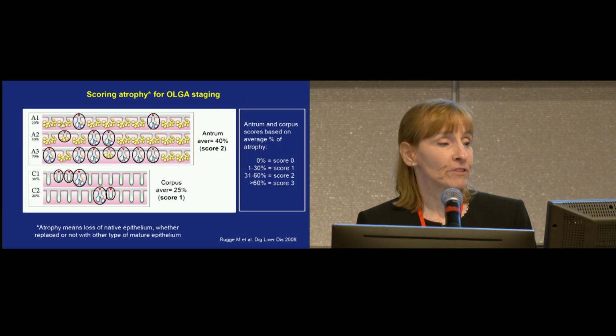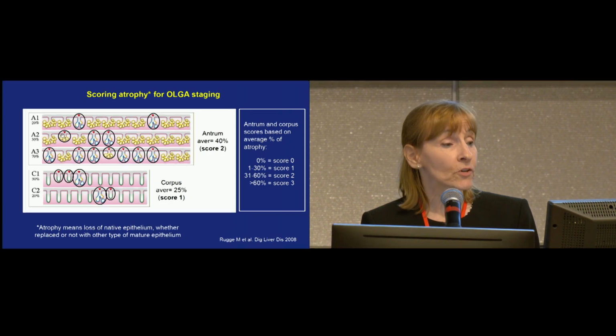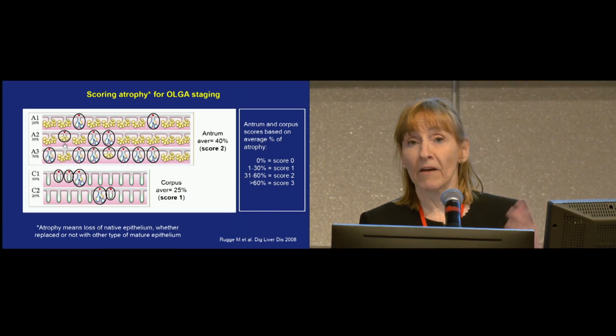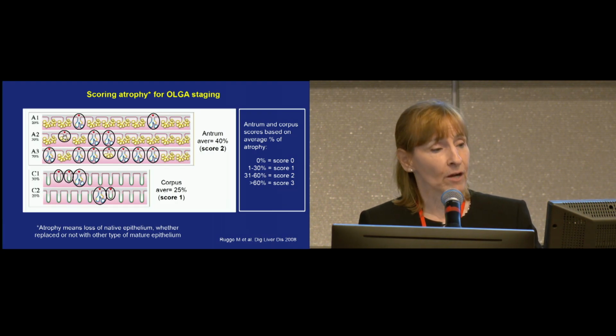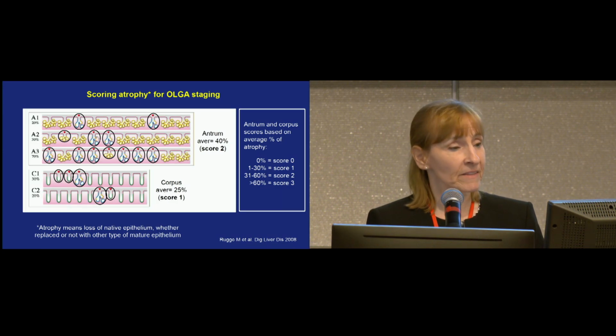So for example, for this biopsy, we have 2, so it's 20% atrophy, you would say. In this one, we also have atrophic glands. This gland is shorter or may have disappeared, so this is also considered atrophy and is counted in the score. For this biopsy, it would be 30% and so on.